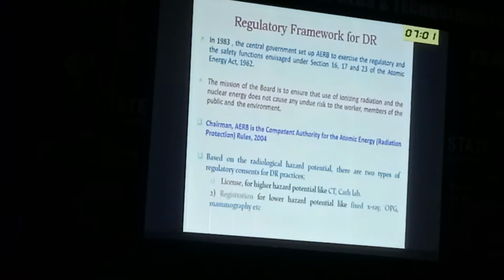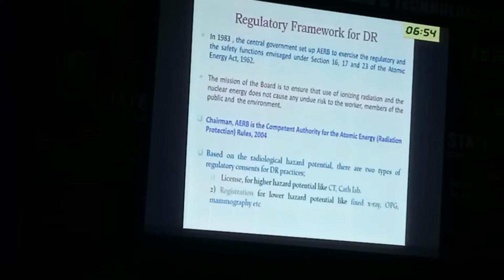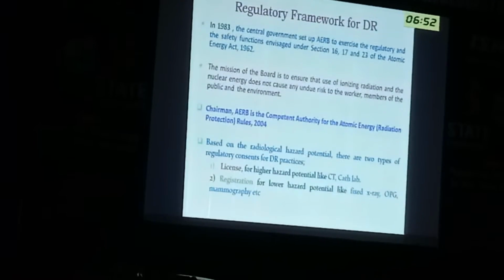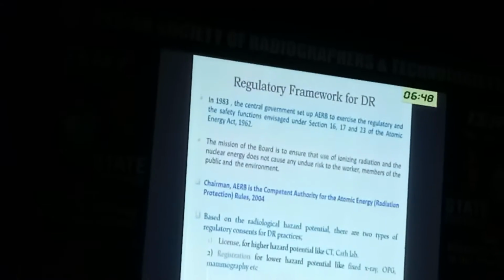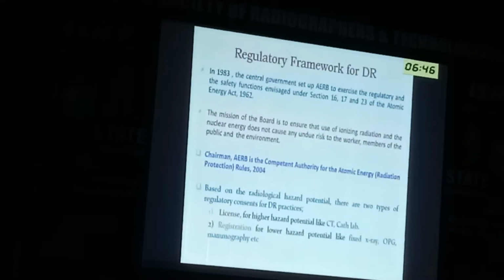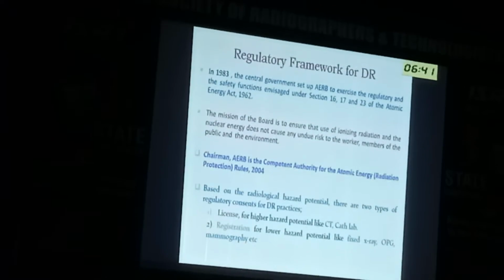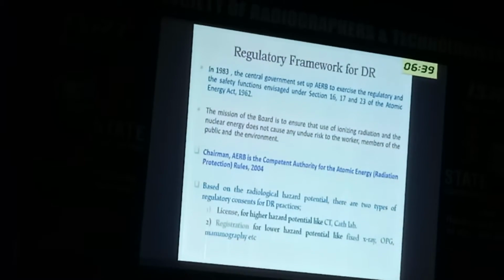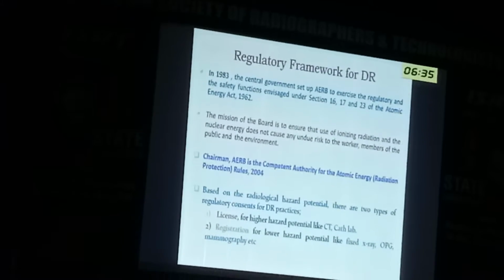So what is the regulatory framework for diagnostic radiology, or rather, we can talk about radiation facilities. Our AERB was set up on 15 November 1983, to exercise the regulatory and safety functions envisaged under sections 16, 17 and 23 of the Atomic Energy Act 1962. So this is the mother act for governing atomic energy substances in India.